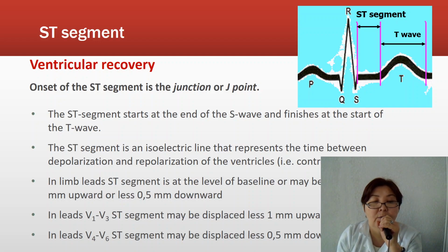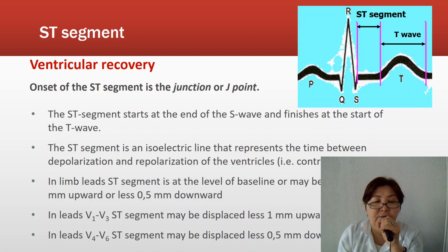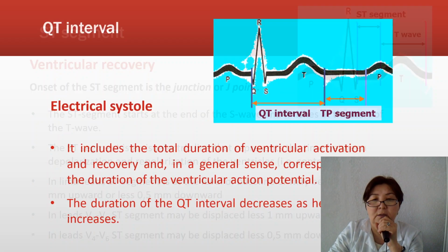In leads V1 to V3, the ST segment may be displaced less than 1 mm upward. In leads V4 to V6, the ST segment may be displaced less than 0.5 mm downwards.